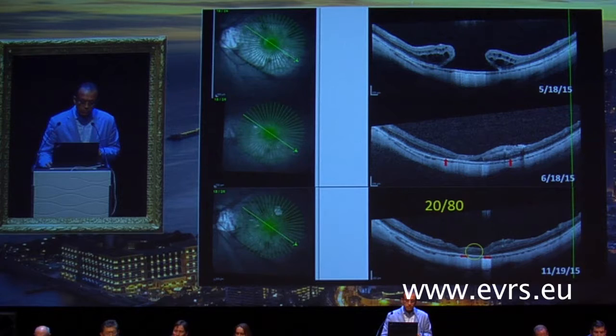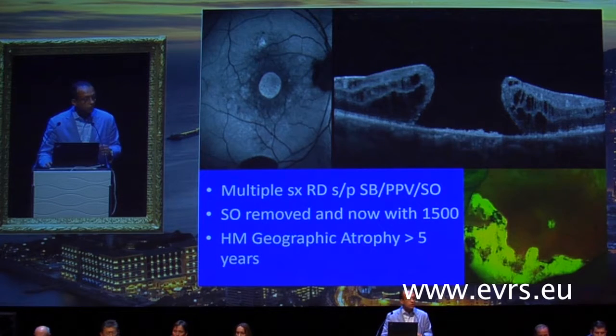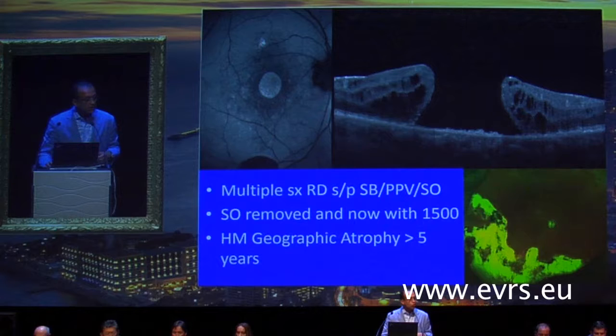And because this was very exciting, I started doing more cases, and that patient comes, I had already fixed a macular hole in his good eye, but then we talked about the technique, and he said, why don't you do it on this eye? So this is a very large 1,500 micron hole, he had lost vision, hand motion, for more than 5 years, also had multiple detachments, and has baseline geographic atrophy. So I thought the transplant is not going to survive.